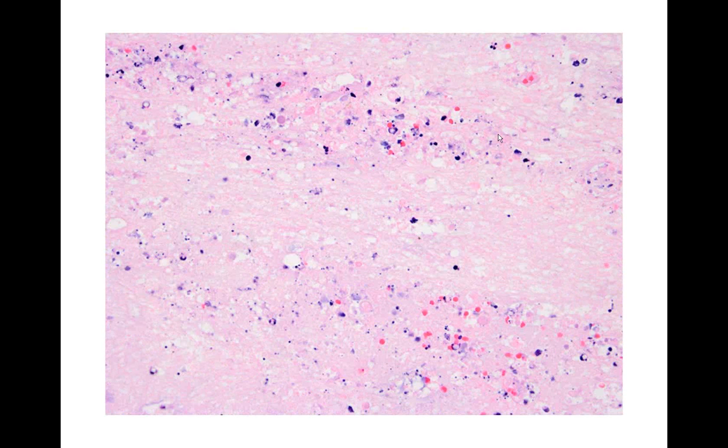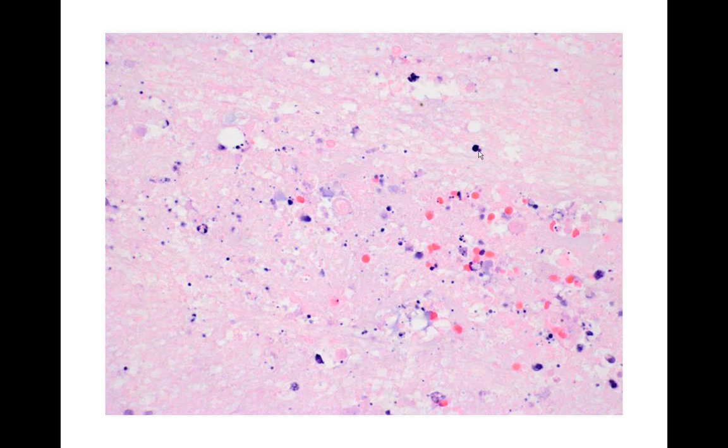And we're seeing all that junky debris, the little flecks of blue all over the place. And the more I looked at them, I'm like, boy, I think this isn't just debris. I actually think these might be little parasites just floating around in that dead tissue. And this in particular, things like this and this look like dead toxoplasma cysts to me. But I found out that they had already suspected it might be toxoplasma, so they were treating the patient ahead of time with antibiotics. And that would explain why everything was so dead.